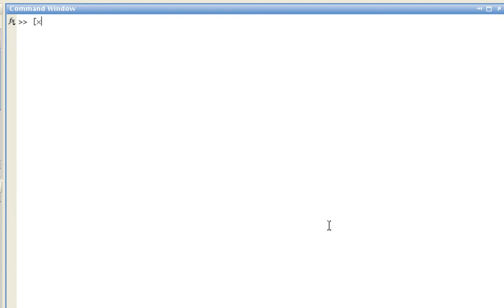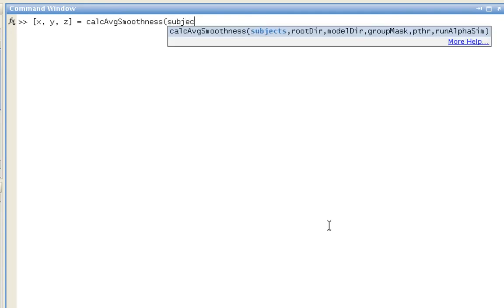Let's say that I want those three variables, the estimated smoothness in the x, y, z directions. I'll type in the name of the function, and give it the subjects list, the root directory variable, and the model directory containing the res.ms file.